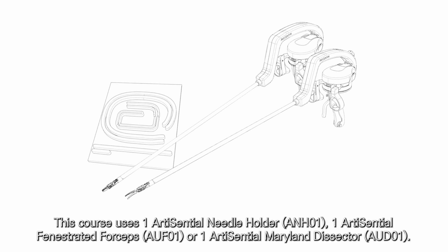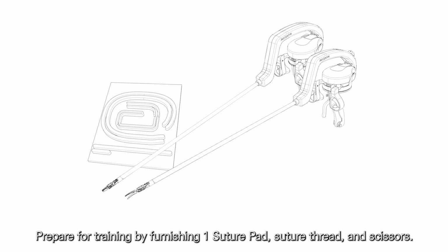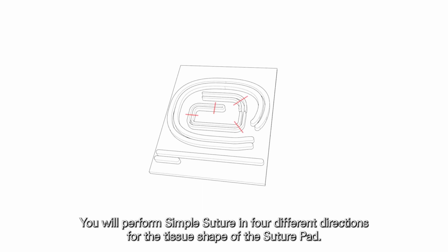This course uses one ArtiSential needle holder, and one ArtiSential fenestrated forceps or one ArtiSential Maryland dissector. Prepare for training by furnishing one suture pad, suture thread, and scissors. You will perform simple suture in four different directions for the tissue shape of the suture pad.